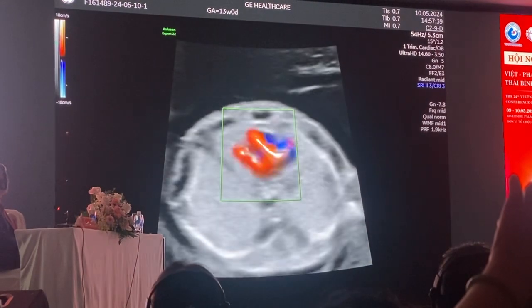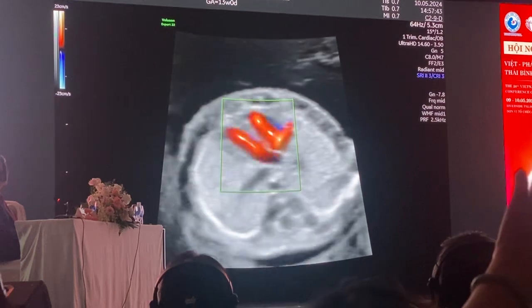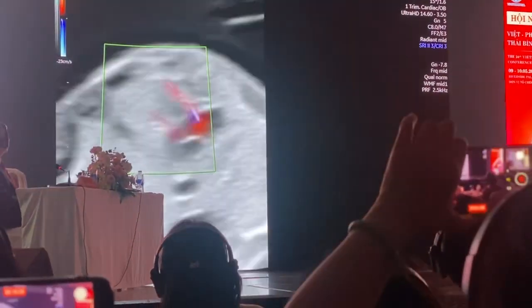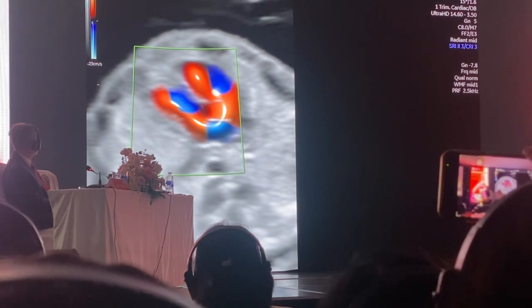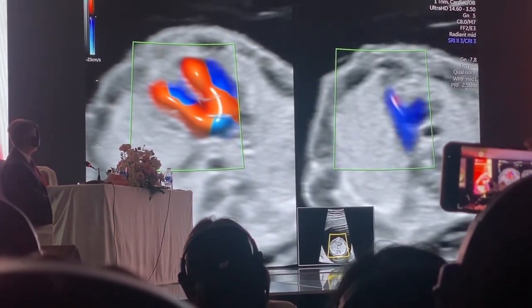Once I've got a power setting, it's on 18. So I set this first, and I got it on to 23. Once I've got the power setting on 23, I then just split the image, and I just do my screening examination, where I get the inflow into both right and left cardiac ventricles. And then I do a split screen just showing me my 3-vessel tracheal view.